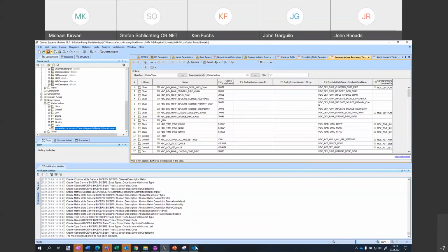So in short, just to summarize, what you did is you started with a BICEPS model in here, right? That's true. That you then profiled for the infusion pump. Yes. You imported the current infusion pump terminology table. And I think I saw some exchanges with Paul Schluter yesterday where you're trying to get some additional event codes and other information. True. But that's what you put in this table here. And then you profiled your BICEPS SysML for an infusion pump, and you cover not only metrics but also alerting and control. Specifically, you were targeting the kind of control that we're looking at in the Madeira project, right? So you want to be able to support closed loop control.